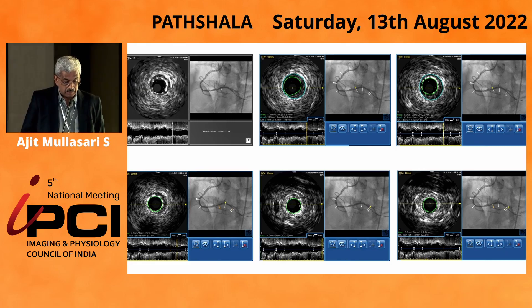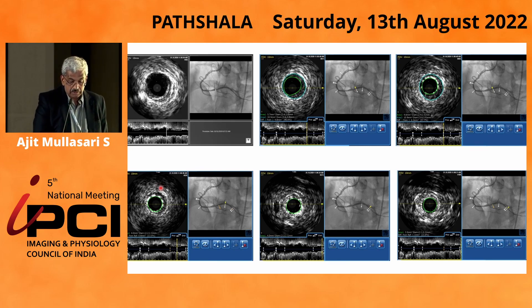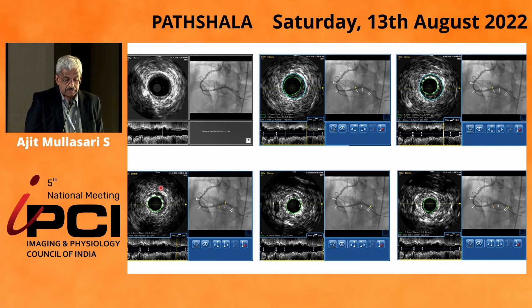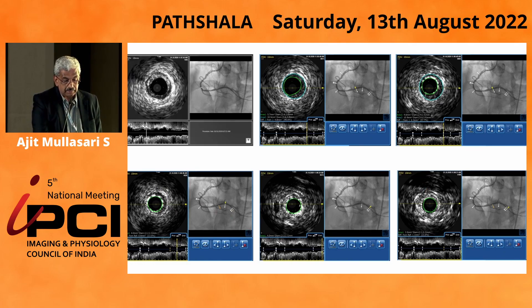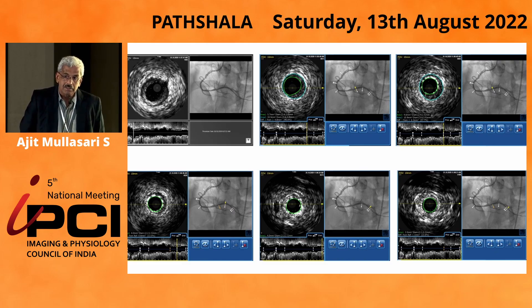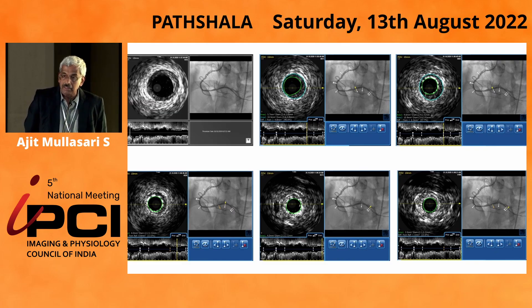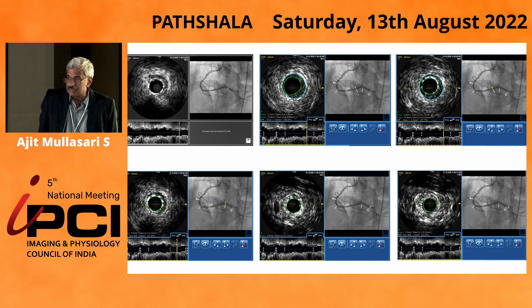You can see the stent is reasonably deployed distally. The lumens are pretty much good distally, and within the stented area they're okay. They're okay distally. And just as you pull back, you can see a flap. Possibly this is created when we put the stent or the balloon, or when tackling the distal vessel.